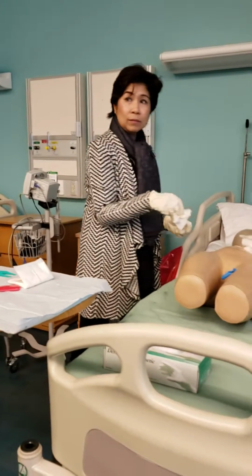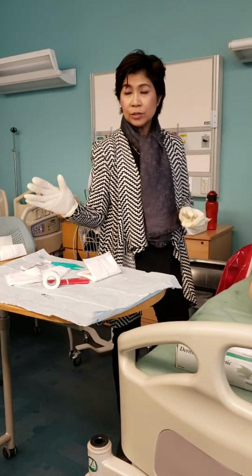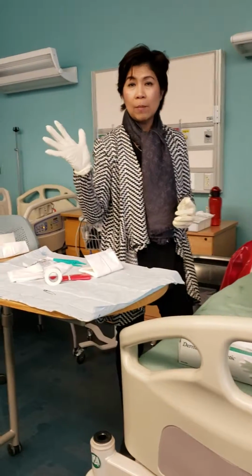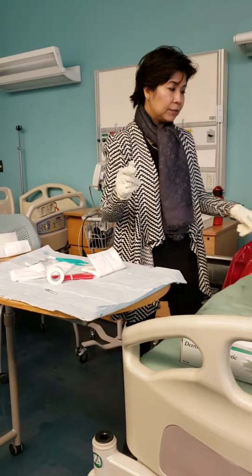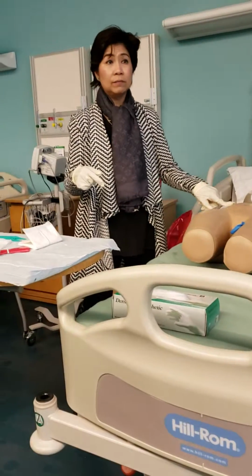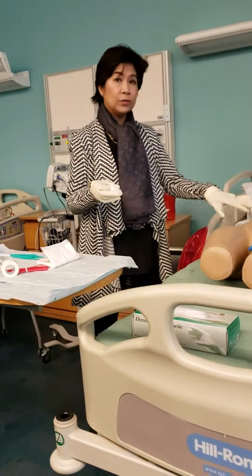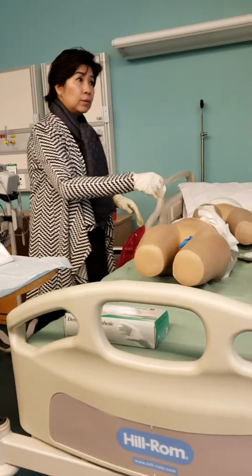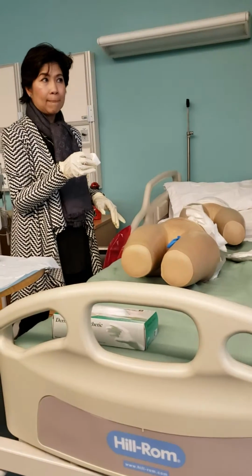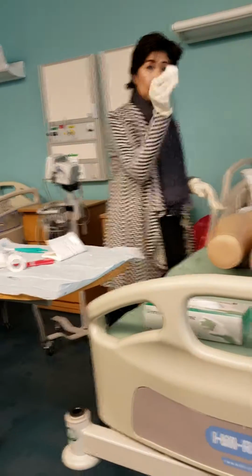Are you using both hands or just one hand to clean and the other to grab the gauze? I'm just cleaning it, so it doesn't really matter what hand. I'm dominant, and this is like a closed suture, so I'm just cleaning it. If you want to get technical, this is more of a clean procedure. You're using sterile stuff, but it's not sterile like surgery.